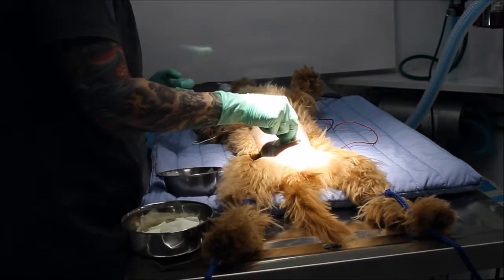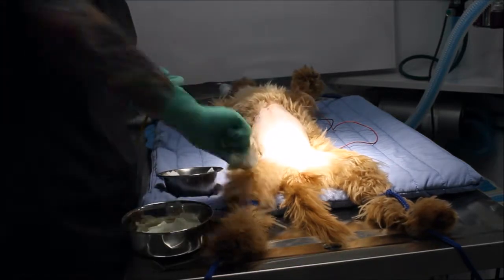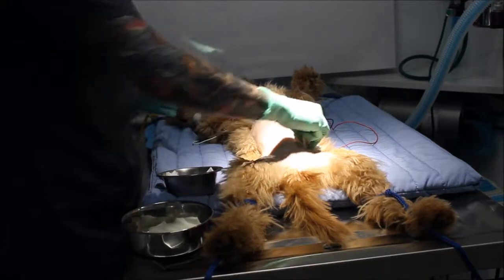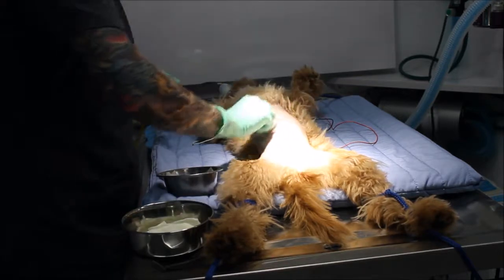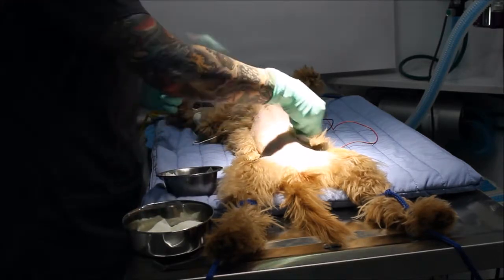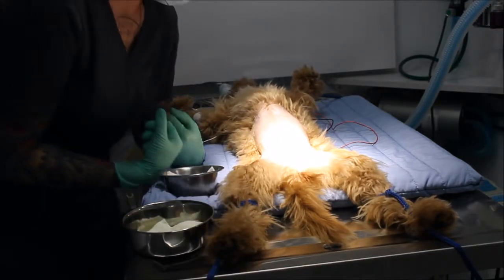Discard that one. Continuing with additional passes — one more time. Okay, so now she is ready for surgery.